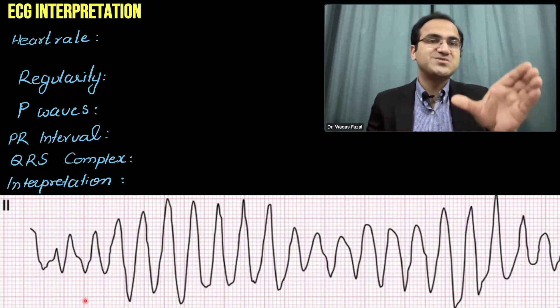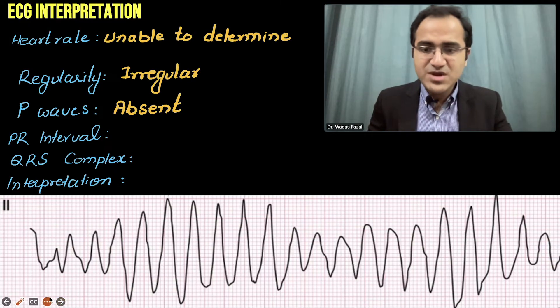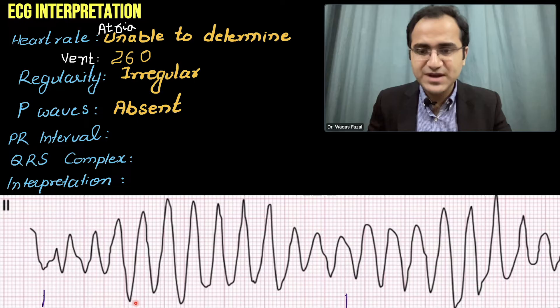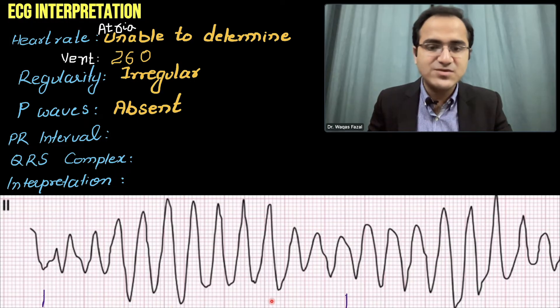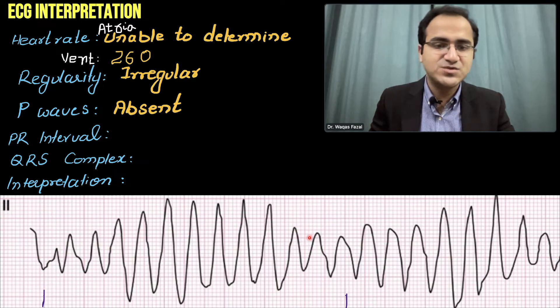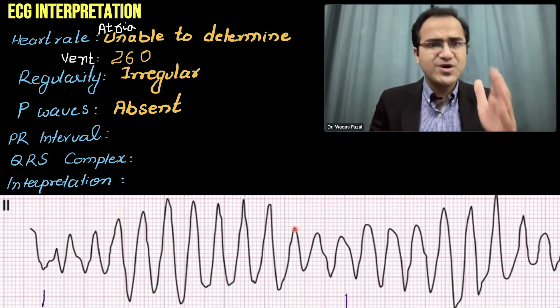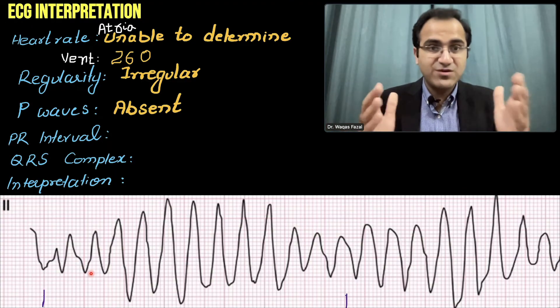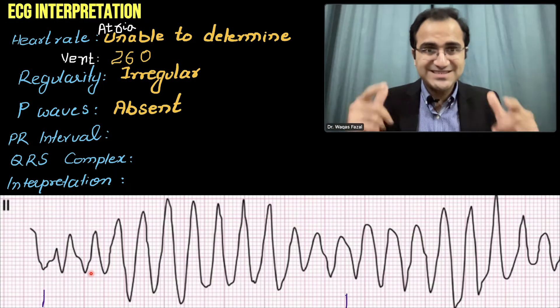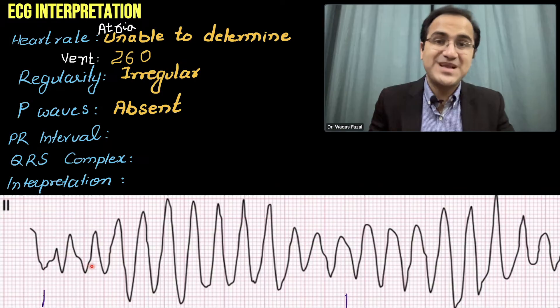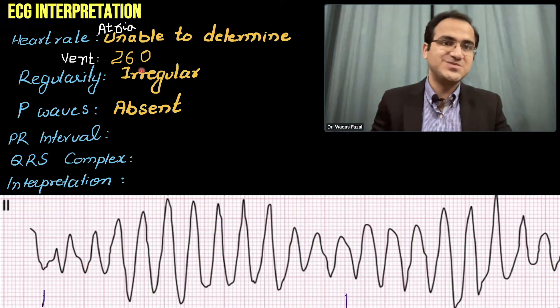Counting 15 large boxes, we find approximately 13 QRS complexes within those 15 large boxes. In 30 large boxes that would be double — 26 QRS complexes. Multiplying 26 by 10 gives 260 beats per minute. So the ventricular rate is 260 beats per minute.